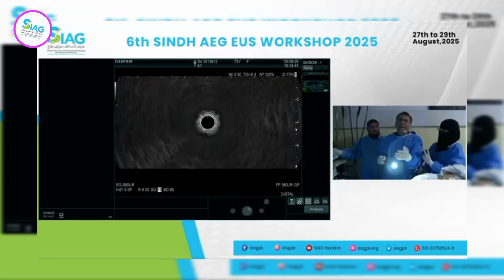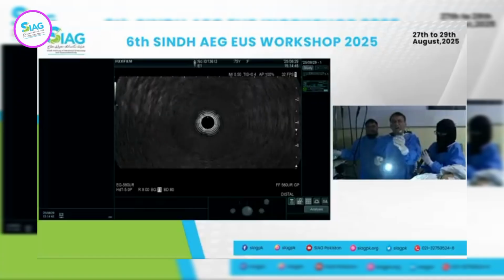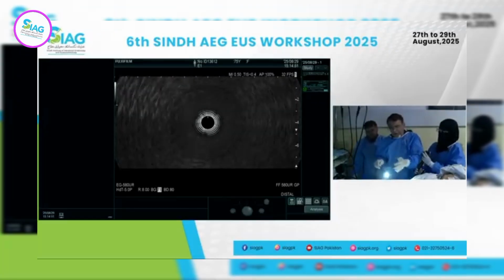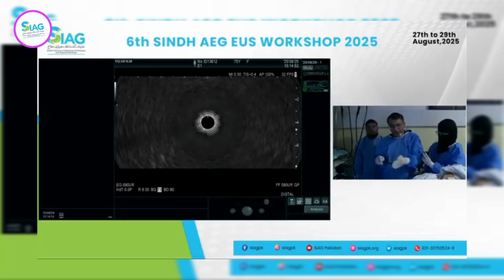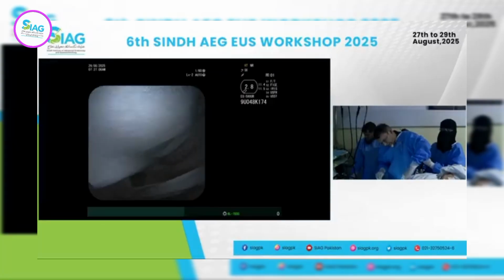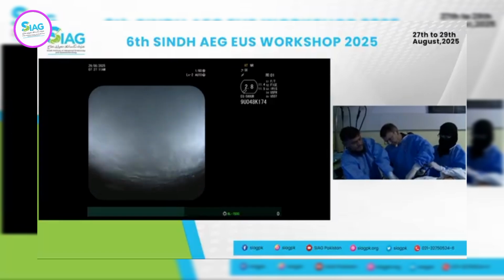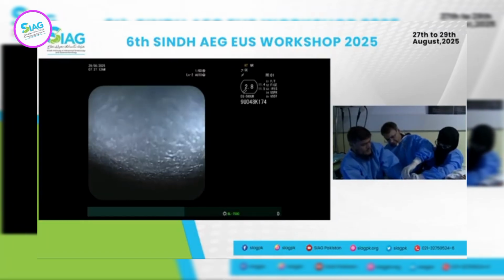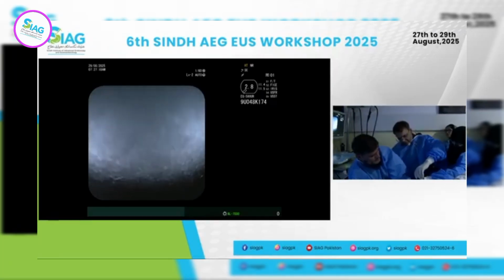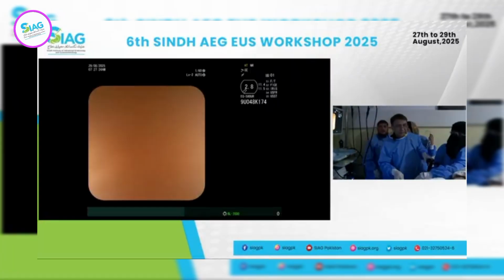The reason I do that is, if people are watching, especially in the conference, just to be more respectful, I usually freeze the endo image, then go into the rectum, and then I turn it on. But in this case, there is no freeze button. Is there a help now? Okay.